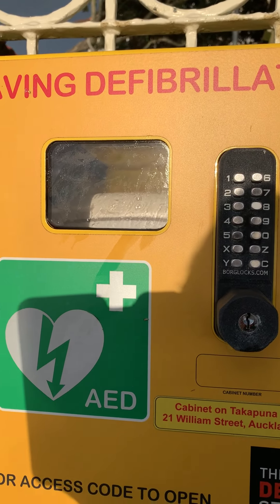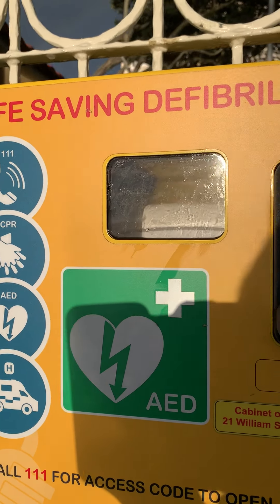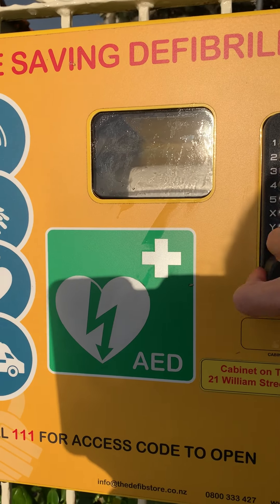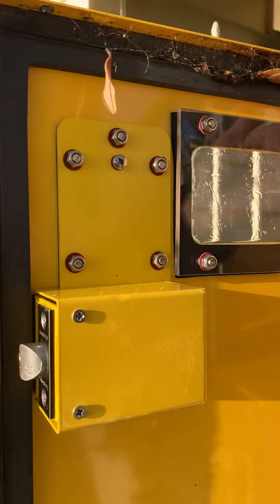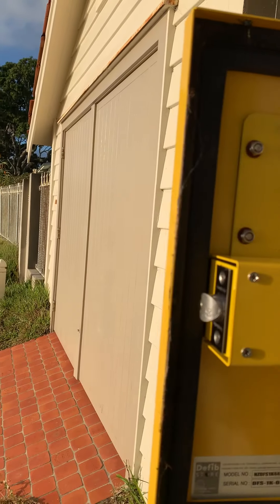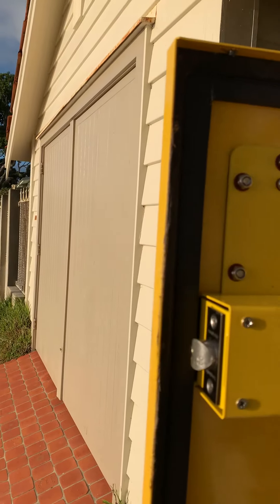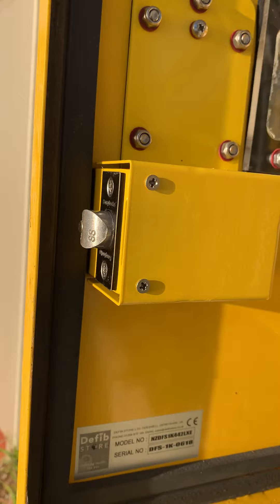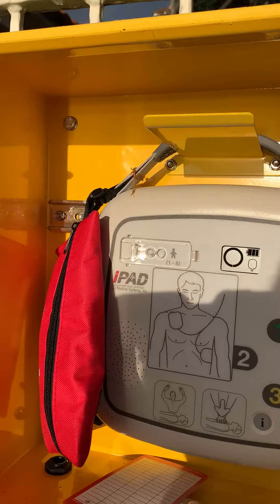A call to 111 is going to give someone needing this defib the access code, so we just punch that in. A few spiders have made their way in here but not much else. The paint is still immaculate, the lock is still in good condition — these are manufactured from 316 stainless steel just to make sure we best protect the defibrillator inside.